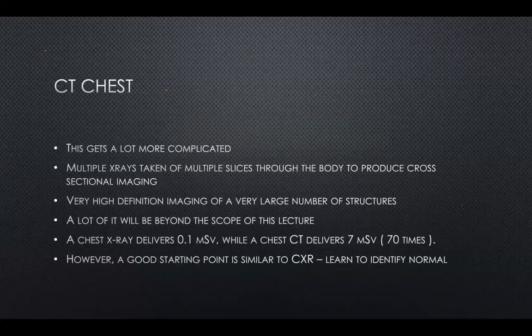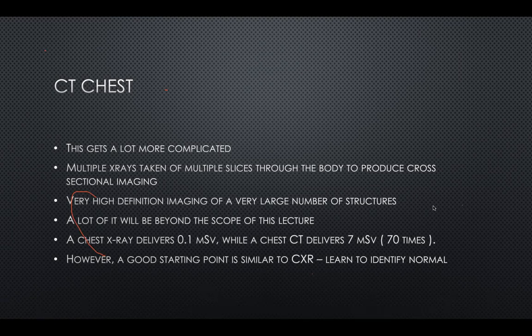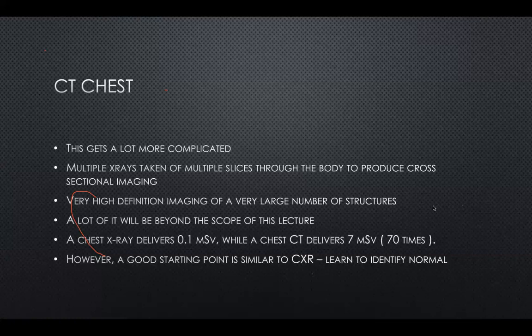So CT chest in the UK is quite specialised. It is very complicated to be able to go through a CT chest, and I don't think any junior doctors or medical students would be expected to be able to go through it in any form of detail. But I think knowing the basic anatomy of it and the basic findings on a CT chest is important. So what is a CT chest?